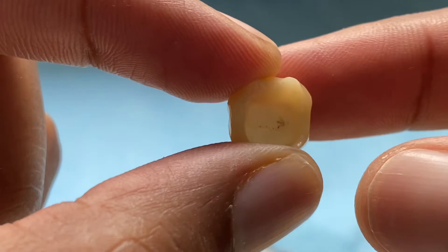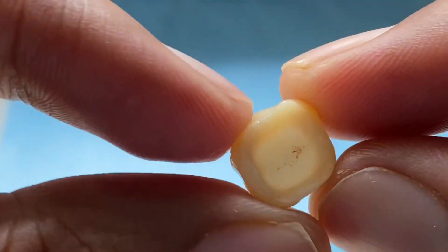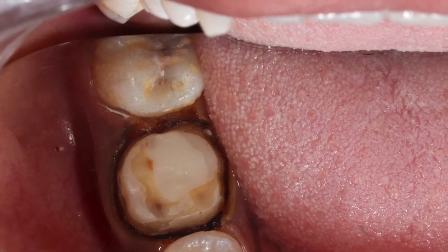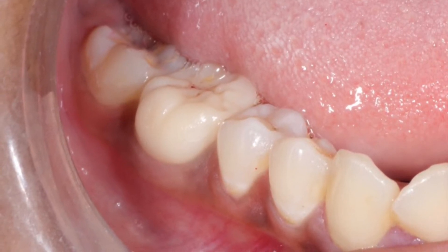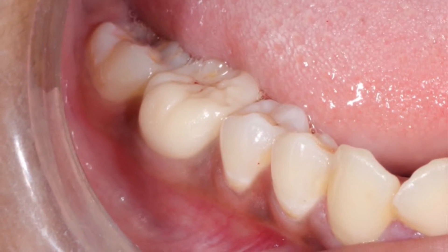Check the entire surface of the zirconia crown — whether it is sandblasted or not, it should be in a matte finish. Clean the prepared tooth with non-fluoridated medium abrasive paste or pumice. Try in the crown and check the marginal adaptation and contact points. Verify the occlusion with articulating paper and correct it with appropriate burrs.